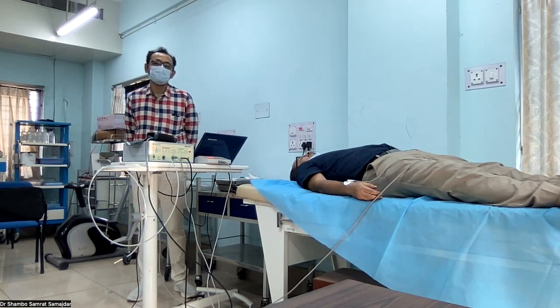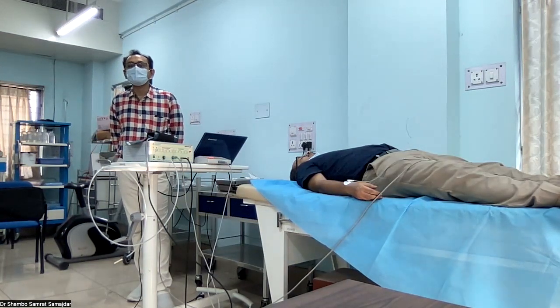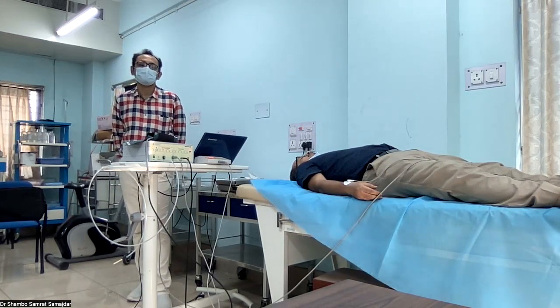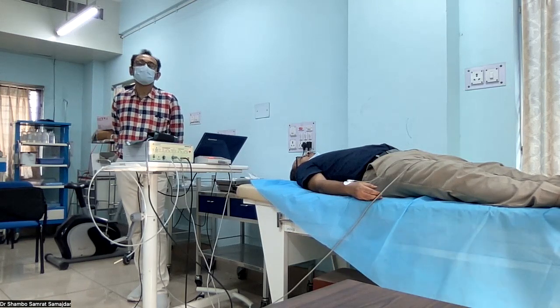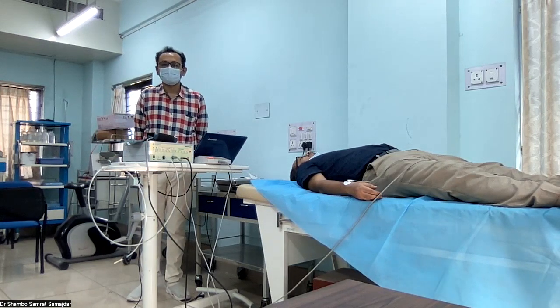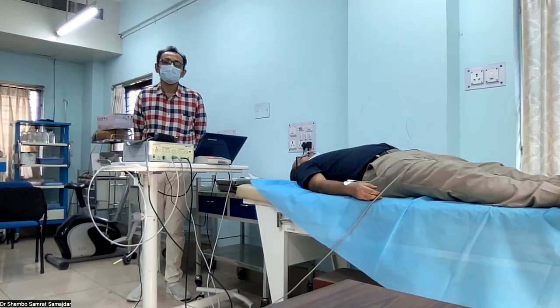And as the HF determines the parasympathetic nervous system function, and the LF by HF tell us about the sympathetic nervous system function, we need to see the results to analyze whether the patient has sympathetic or parasympathetic nervous system dysfunctions. So let's see what happened in this 5 minutes ECG. So these are the protocol we need to follow when we are doing the cardiac autonomic neuropathy testing.